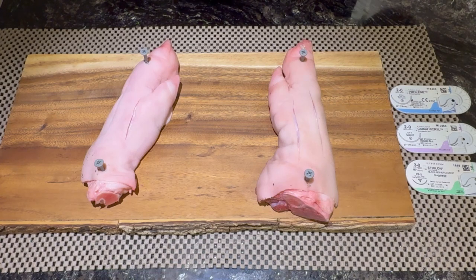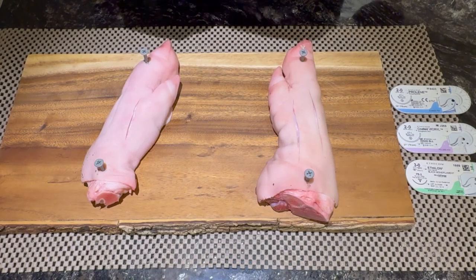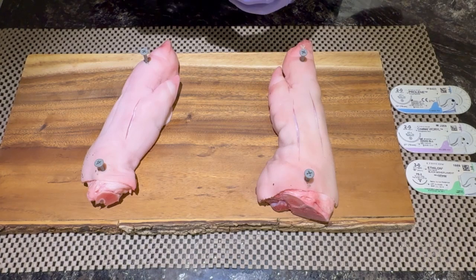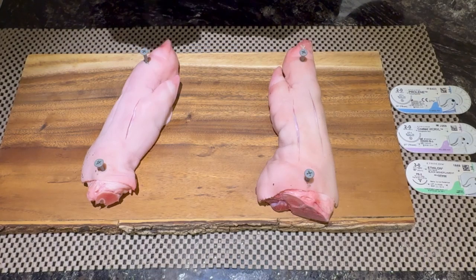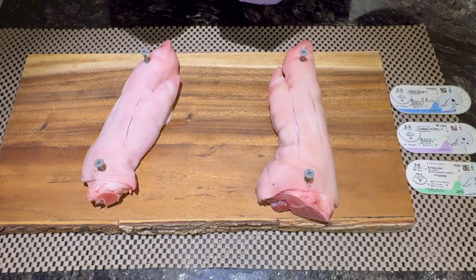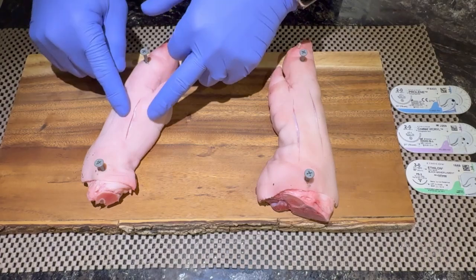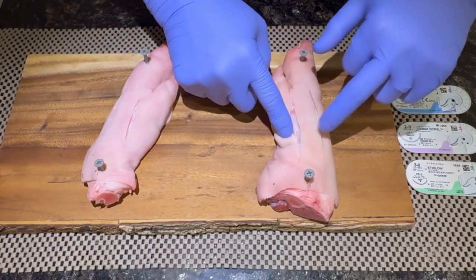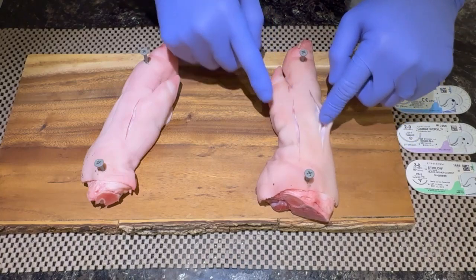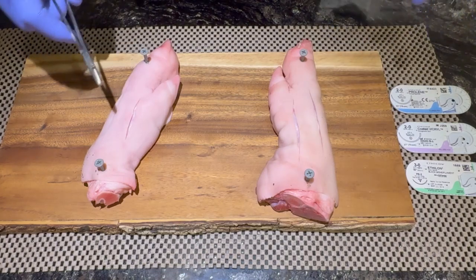When we encounter a wound, the first thing we should take into consideration is the quality and the depth of the wound. We should look at whether it's a superficial wound or a deep one, whether it's clean or dirty, or if any other structures are affected. Typical wounds: I have very superficial wounds here, and a deeper wound here that involves more than the skin. In this case, we have just a simple wound.